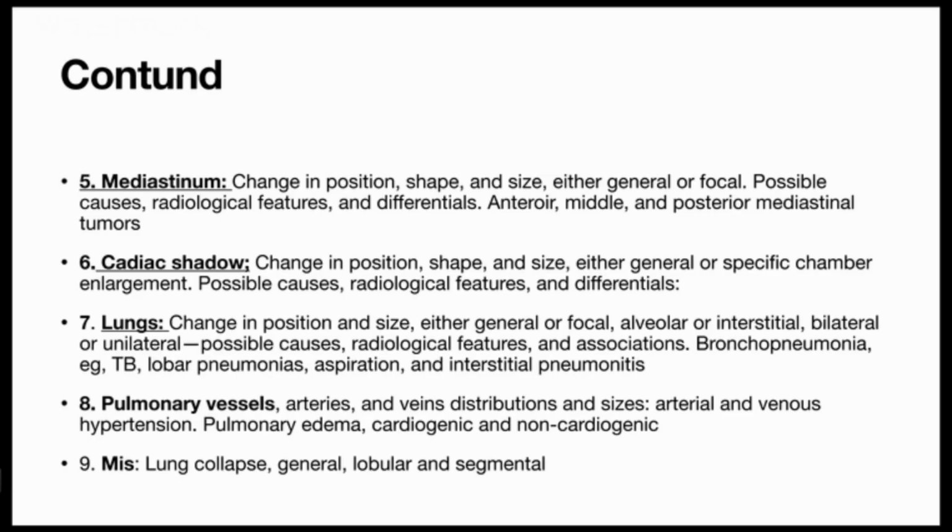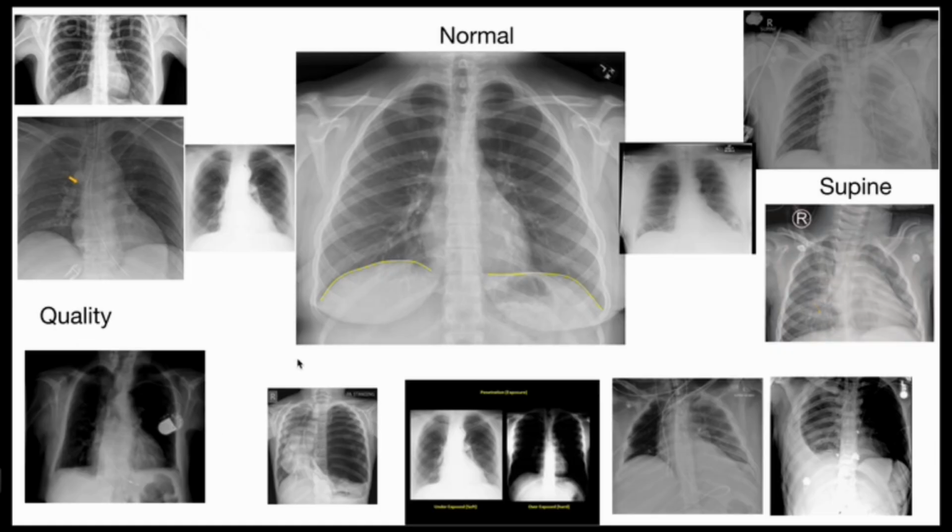And then finally, we look at the lungs. We want to look at the lungs finally, because this is many times where we have the disease processes, and that's how we shall be handling these sessions.